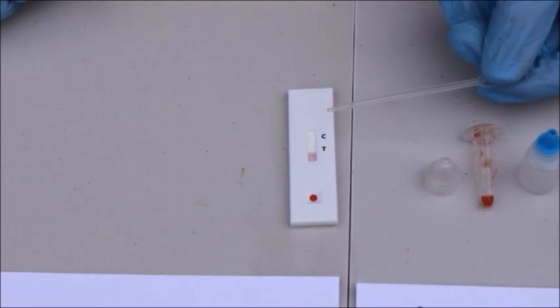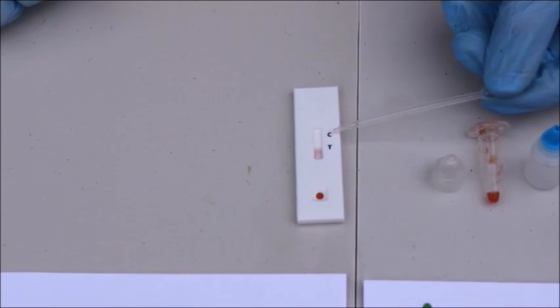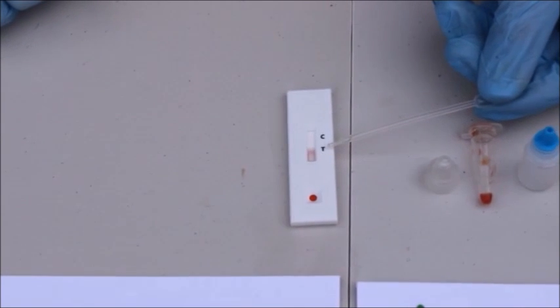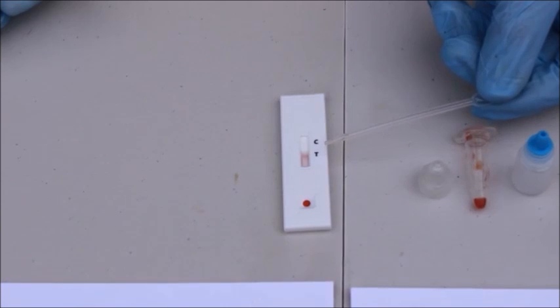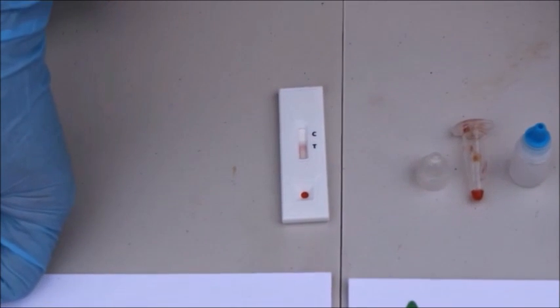On the test cassette itself, we have two lines. We have a control line to indicate that the test cassette is working properly, and a test line which will indicate whether the cow is either pregnant or not pregnant. For this to be complete, it will take ten minutes as indicated in the short instructions.